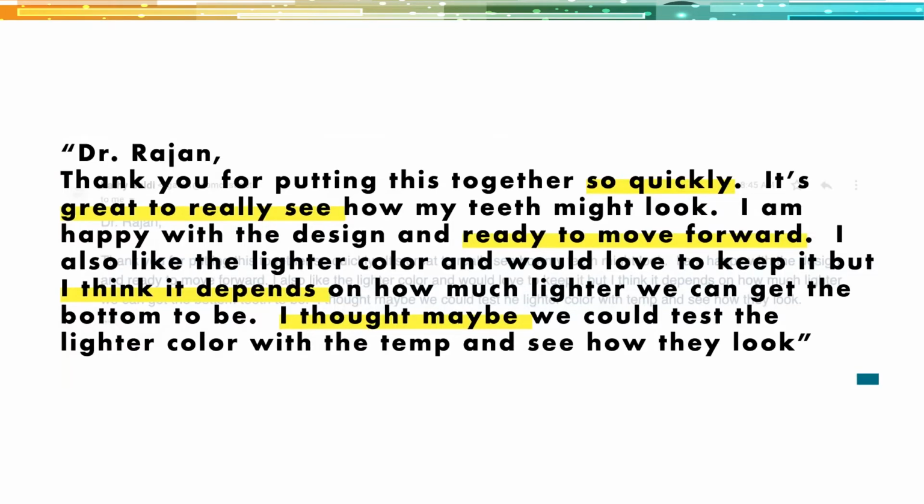And when I got that response, it really clicked in my mind that this is the culmination of this process of really engaging the patient. This process has gone from something that I'm planning to do to Kathy to something that I'm doing for and with her. And it really gets the patient on the side. I love the fact that she now realizes that there's going to be a limitation to how white her top teeth can be, with the fact that her lower teeth are not going to be treated. These are the kind of things that you don't want to have to address after you've done the treatment, because then it sounds like an excuse.